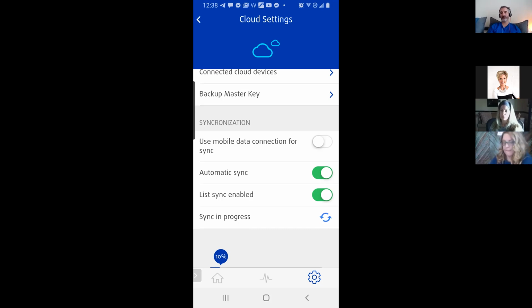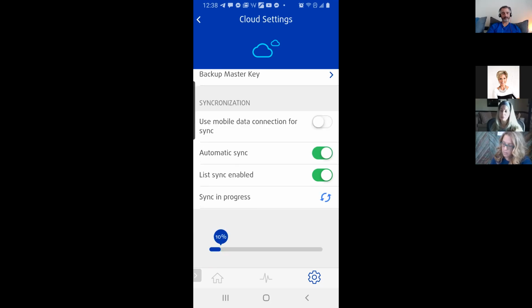The device will actually tell you that. It will say, oh, if you're not connected to Wi-Fi right now, it won't sync it. But if people blow that off and ignore it and keep going, and then they run into an issue where they have to reset their device and didn't use mobile data connection for sync, yeah, it's all gone, okay? And it's syncing, 10% at the moment. Yeah, it's got a lot to sync. Anyways, I think that's good for that.